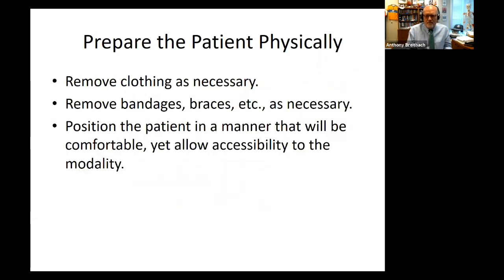We want to prepare the patient physically. We want to remove any bandages or clothing, but we do not want to have them, for example, a female track athlete is probably just fine with a sports bra and spandex on a treatment table. But my grandmother probably is not. So you need to make sure that you drape people appropriately and you think about patient privacy and all those types of things like that.